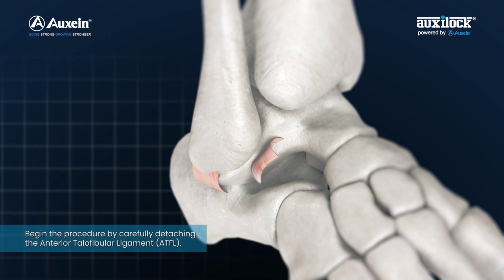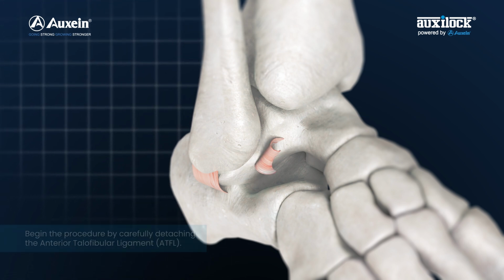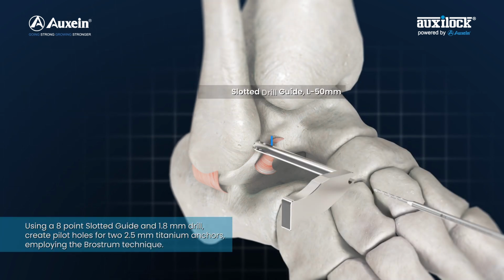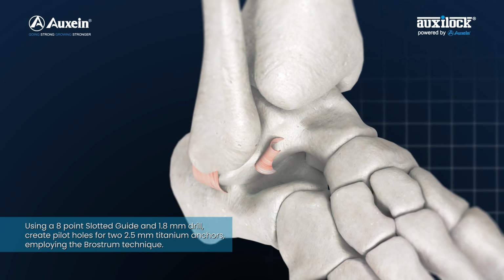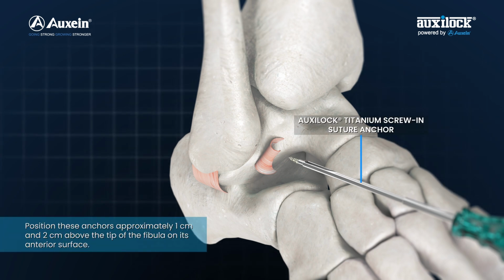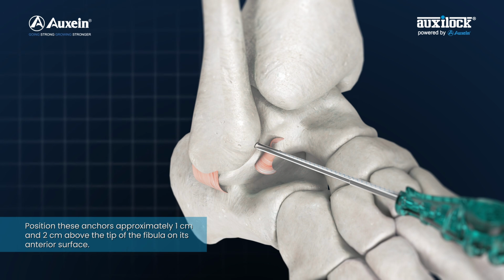Begin the procedure by carefully detaching the anterior talofibular ligament, ATFL. Using a 8-point slotted guide and 1.8 mm drill, create pilot holes for two 2.5 mm titanium anchors, employing the Brostrom technique. Position these anchors approximately 1 cm and 2 cm above the tip of the fibula on its anterior surface.